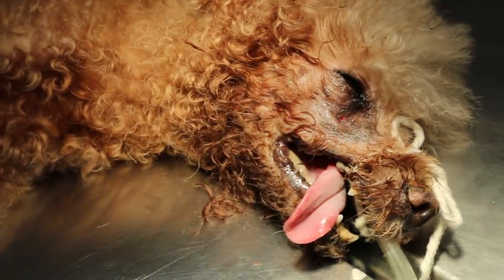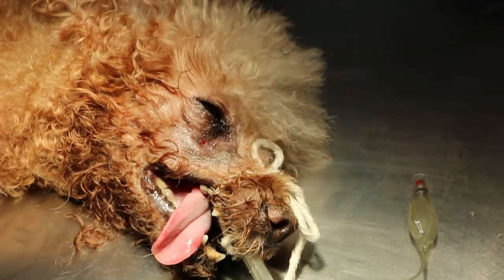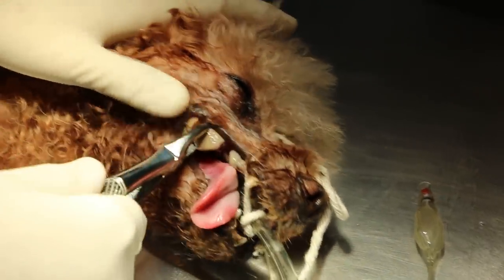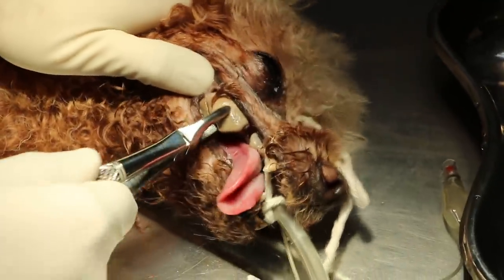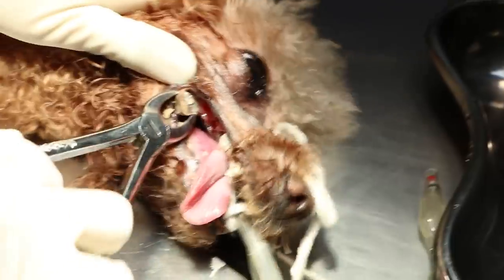Let's do the dental now. Get the container to put the teeth in. This is the premolar 4. The anesthetic gas is at 1%. Write down PM4.